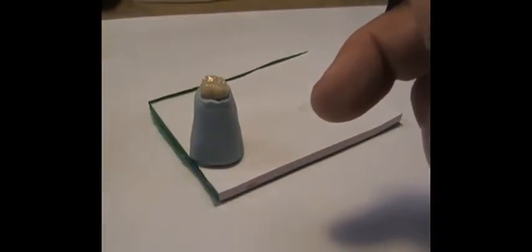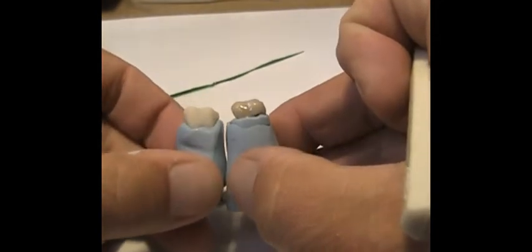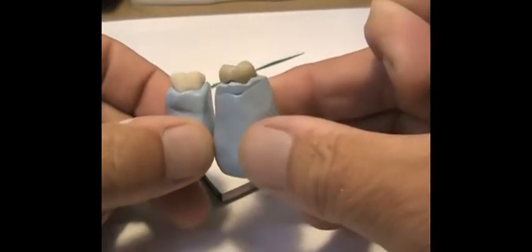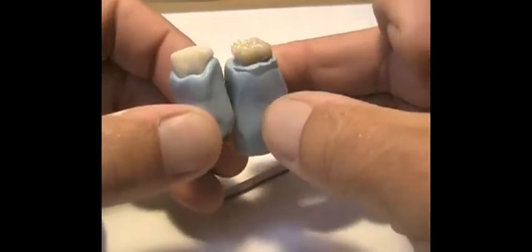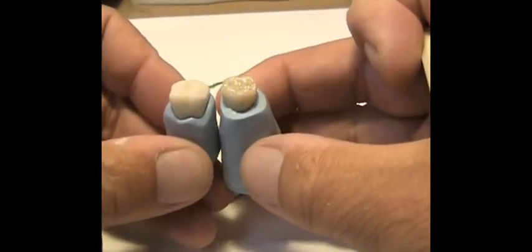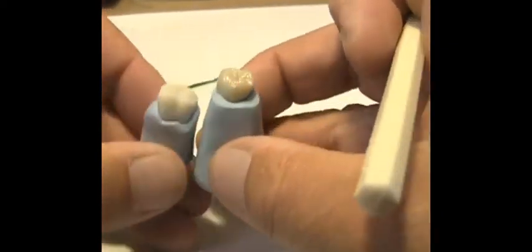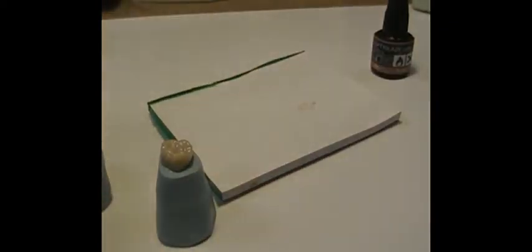Now I'll show you one that hasn't been colorized — they were the same shade — and you can see that I've already started to change the shade, bringing it into an A2 range. Let me get my shade tab for A2 and see how close we are and how much further I have to go.